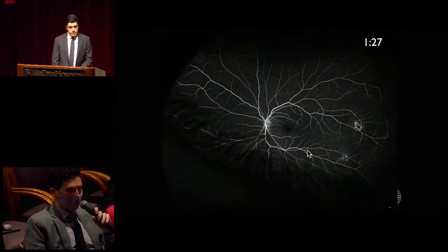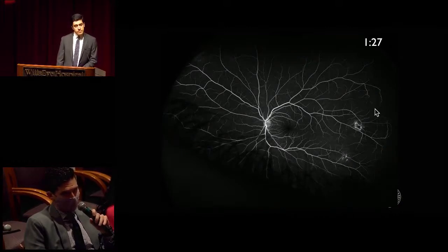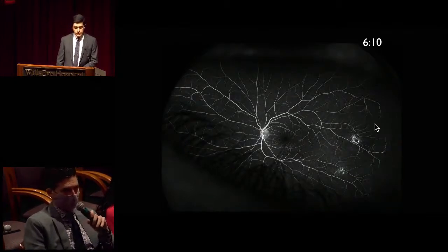And at 1 minute, 27 seconds in the left eye, we see somewhat similar findings to that of the right eye. Again, here these pigmented lesions have mixed hyper and hypofluorescent signal, likely some blockage in those hypofluorescent areas. Again, it looks like the perfusion may be attenuated here in the far temporal periphery, and again, the vessels are starting to take on a bit of a loop configuration. And then in the late frame, notable that there is no leakage, persistent, maybe staining here, and some window defect in those areas. And again, the vessel loops out in the periphery.